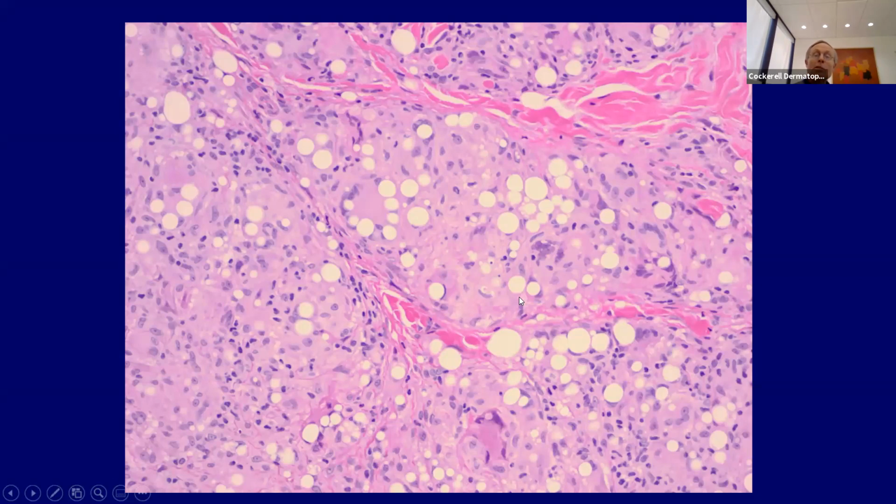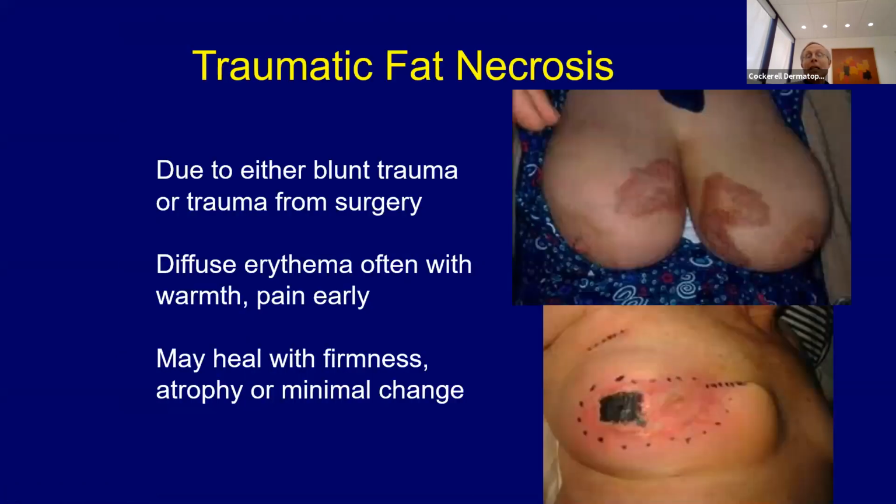If you see crystals and things like that, it's more likely to be a paraffinoma where they've injected things that contain other materials other than the silicone. If they get inflammation with silicone, if they're injecting it for wrinkles, for example, that's supposed to be surgical grade quality silicone, but sometimes people do get a secondary granulomatous inflammation. There may be microscopic amounts of impurities in there. And if you biopsy, it looks pretty similar to what I just showed you there.